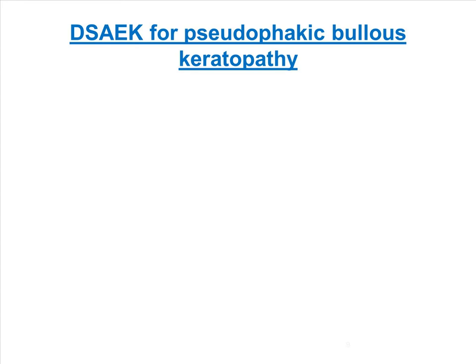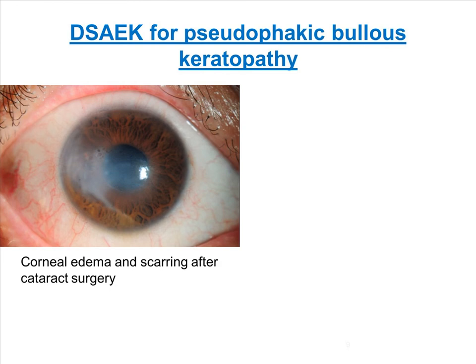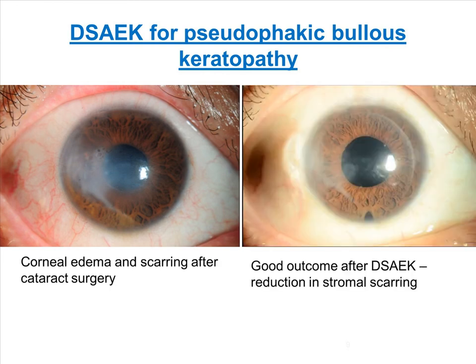Pseudophakic bullous keratopathy can follow complicated or even routine cataract surgery. In this case, we can appreciate that there is evidence of epithelial bullae and stromal scarring from chronic edema, with reduction in edema and scarring following successful DSAEK.